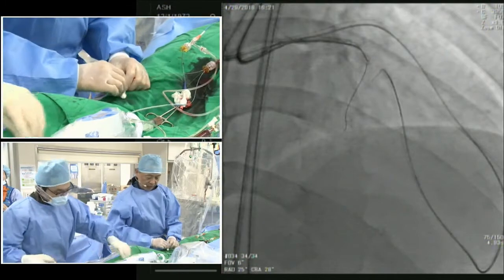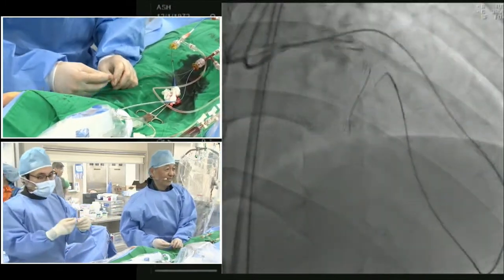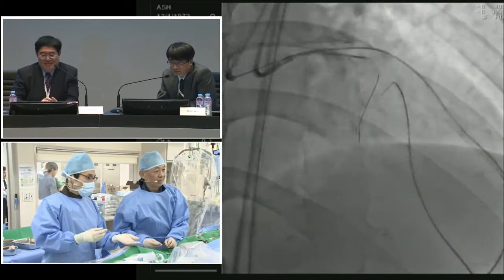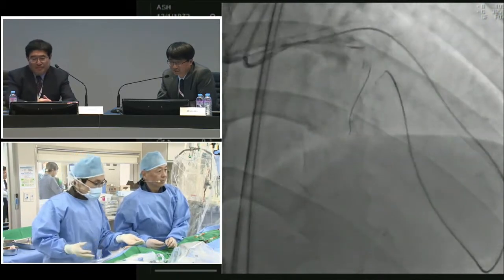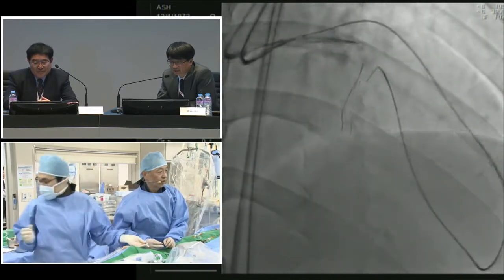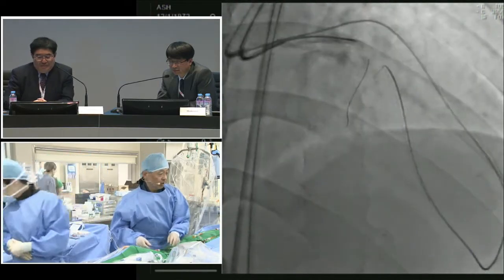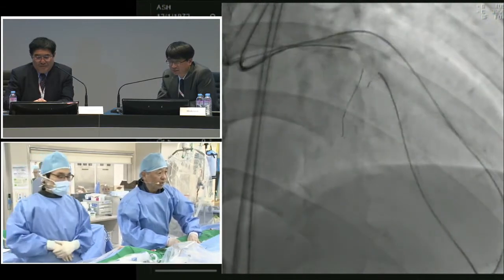Asakura sensei, you don't select UB3 in this situation? Yes, I start with Gaia Second from the beginning. Actually, this CTO region is very short. However, if penetration is possible by using UB3, I think it is better.